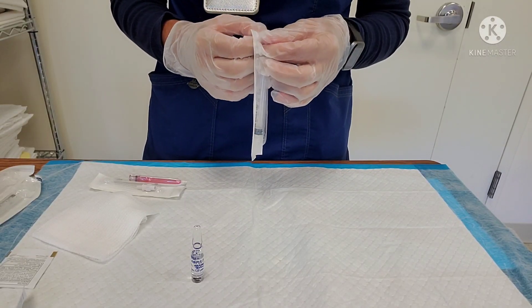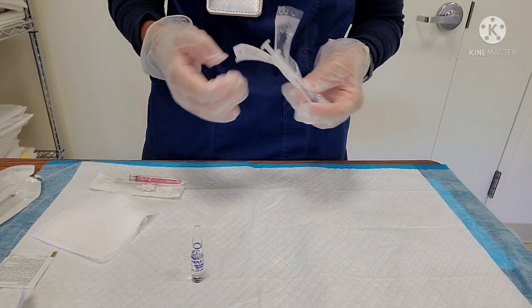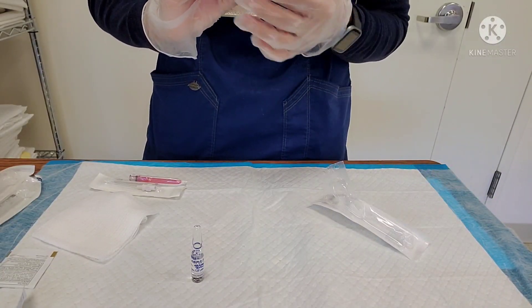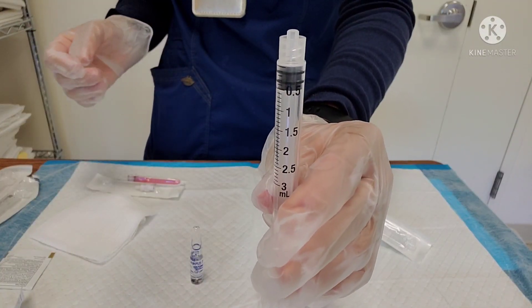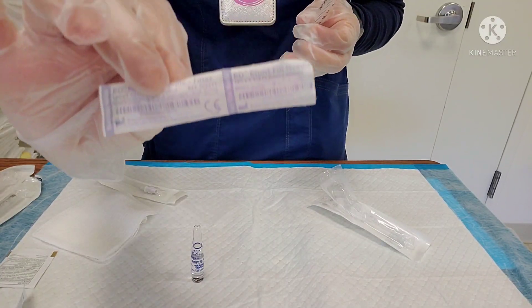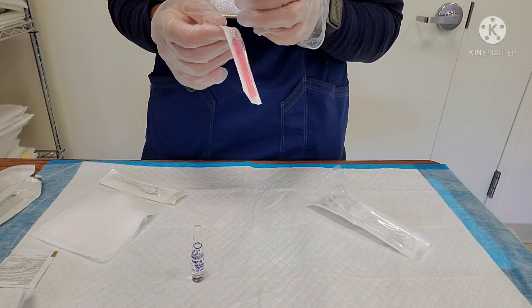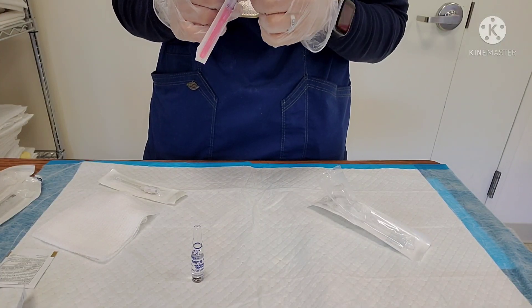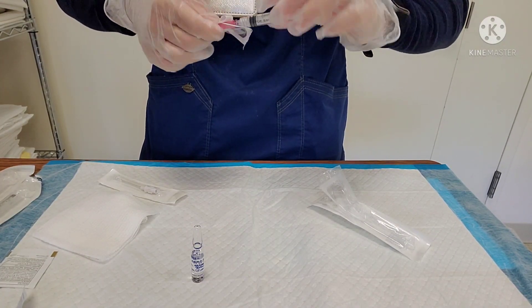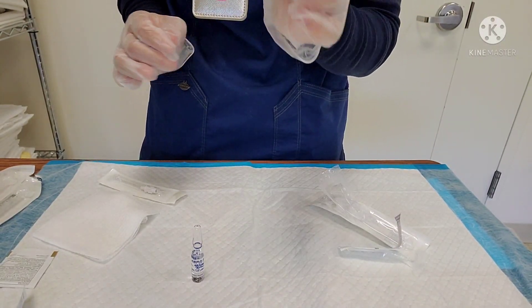While that's drying, I'm going to go ahead and grab a syringe. Today I have a 3ml syringe and I'm going to withdraw 1.5cc. And then I'm going to use my blunt needle, which I showed you earlier — you can see that it says it has a filter. Some blunt needles do not have a filter, so make sure you have one with a filter.